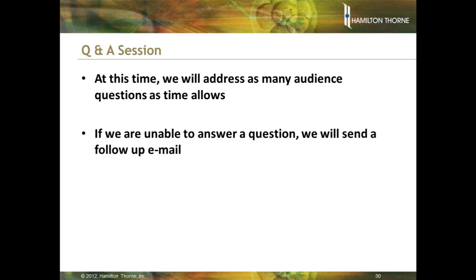Okay, great. And perhaps you can both answer this, but definitely Dr. Behr. What is the proper hole size for blastomere biopsy? Well, my opinion is to create a flap. Dermot mentioned this, although the video that we saw showed an opening that is the size of the blastomere.